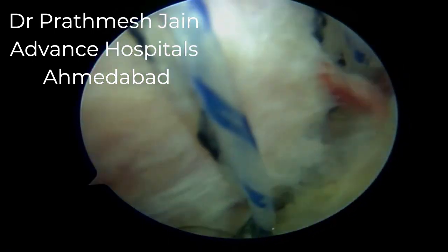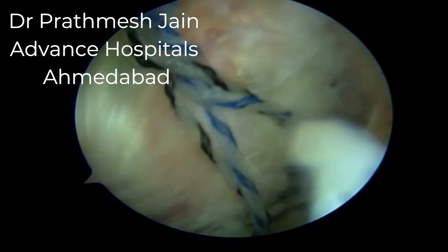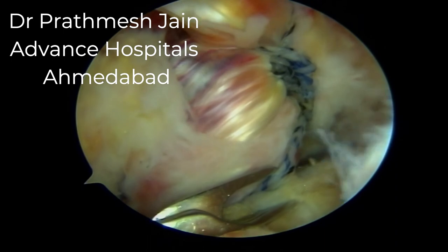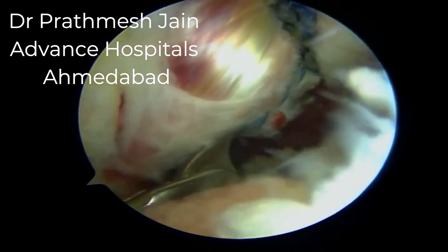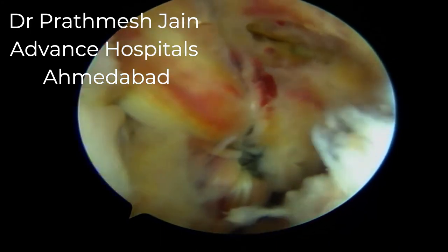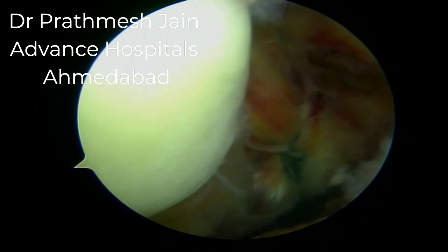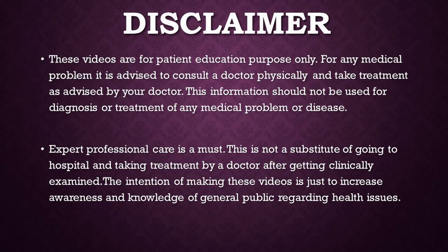We are using UHMWPE high-density fibers, which are very strong. We pull the medial sutures over the bone fragment on the medial aspect and then anteriorly tighten both suture limbs from the medial and lateral tunnels, achieving solid fixation of the PCL fragment posteriorly. The blue and black sutures are tied separately on the anterior aspect, and you can see that the pseudo-laxity in the ACL is gone — the ACL has become stout and rigid.